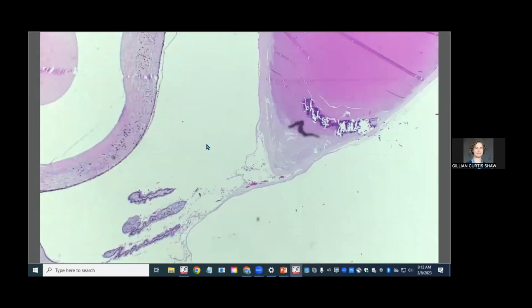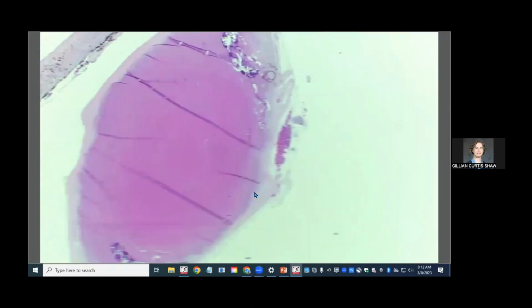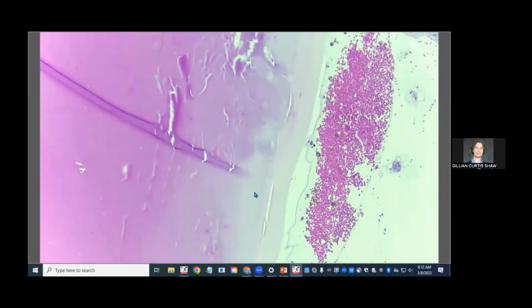So you always have to make sure that your lens is actually oriented in the proper way once you get the slide. And in this case, I think it is, in part because I think it was fairly well anchored here in this globe by this membrane. So you have to convince yourself that you're truly looking at the posterior lens capsule, but it's actually quite thick for a posterior lens capsule. So this is just a congenitally abnormal lens.